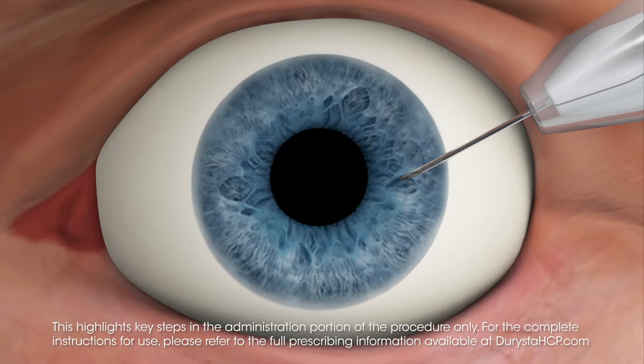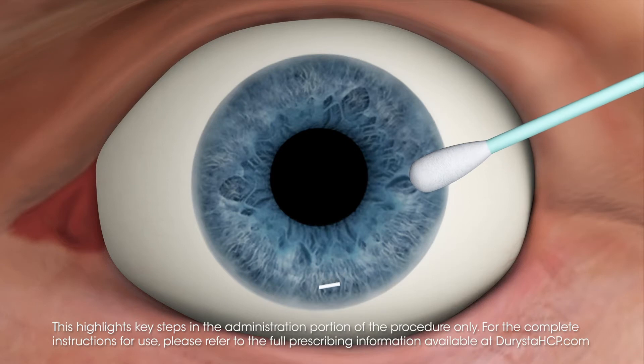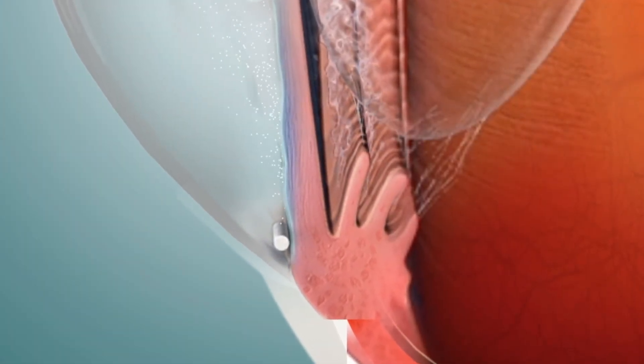Avoid positioning the needle bevel directly over the pupil. Ensure the needle is not bent before depressing the actuator button. Release the implant by pressing the back half of the actuator button until an audible and/or palpable click is noted. Then withdraw the needle and tamponade the entry site. The implant should not be left in the corneal injection track. When administered into the anterior chamber, DURYSTA rests in the inferior aspect of the iridocorneal angle.